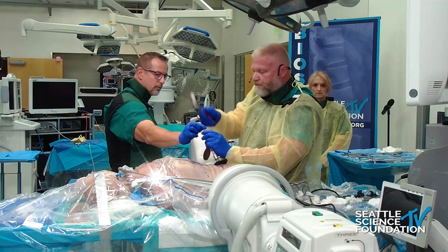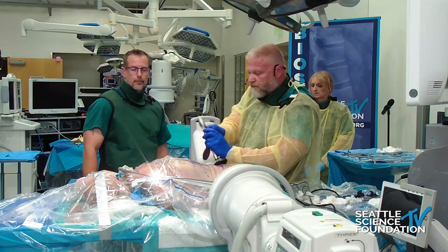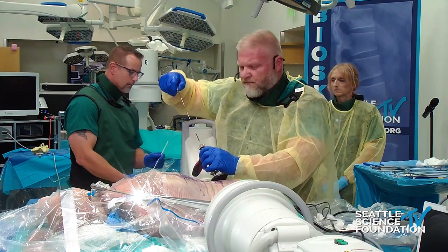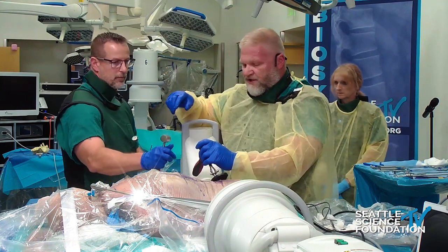For the interest of time, the reason you don't see as much disc prep is because we're running a little bit behind. But usually when we do these endoscopic fusions, you see both end plates, and you do really good disc prep. That's really one of the biggest values of the endoscope, that you can be sure you clear all that disc out. I just haven't had a chance to clear the disc out.